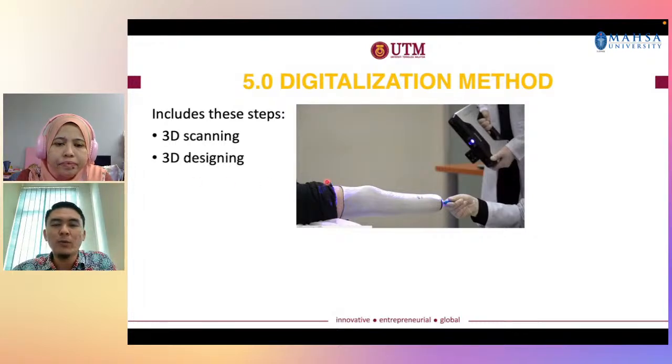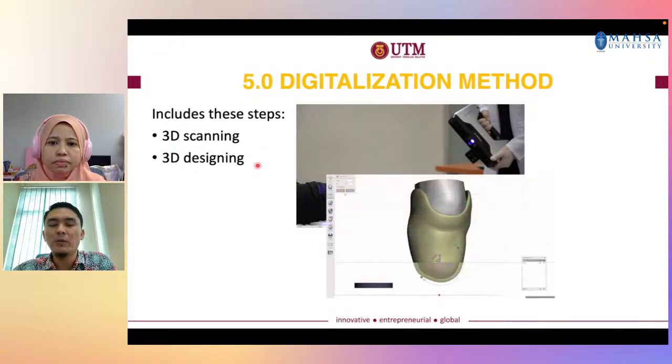So and then once you have the data from the 3D scanner, the process of 3D designing is taking place, where we import the data from the scanner into the computer-aided design software, CAD software.